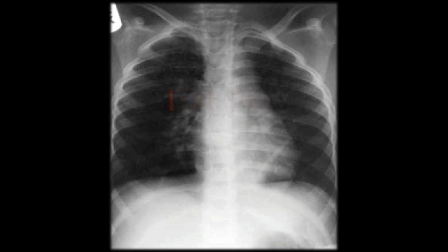Do I have good inspiration? Are the lung fields full? And I would say absolutely. And then do we have good penetration? All that it means is can we see our bony prominences? Can we see our dense areas? Can we see our vertebral spine, our clavicles, our AC joints, etc.? Can we identify the ribs? Can we identify those classic markings? And I would say yes.